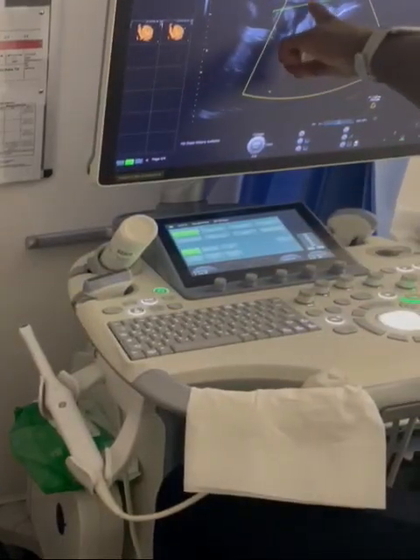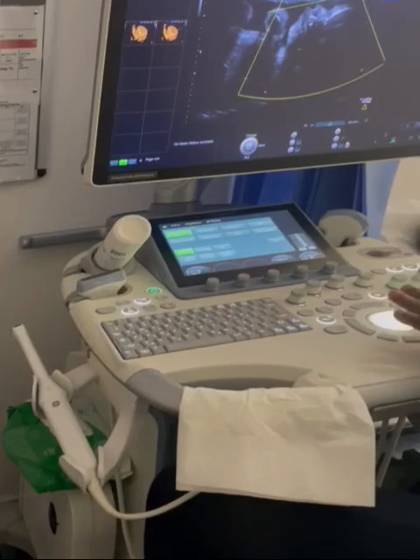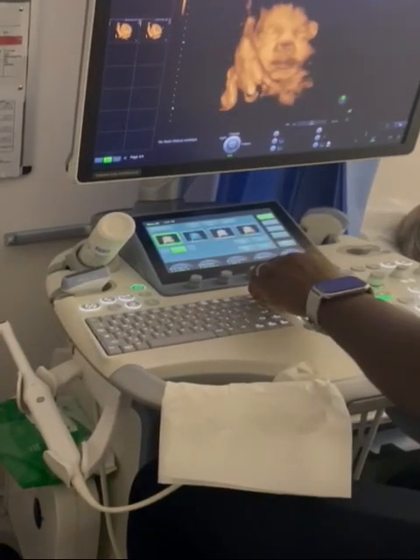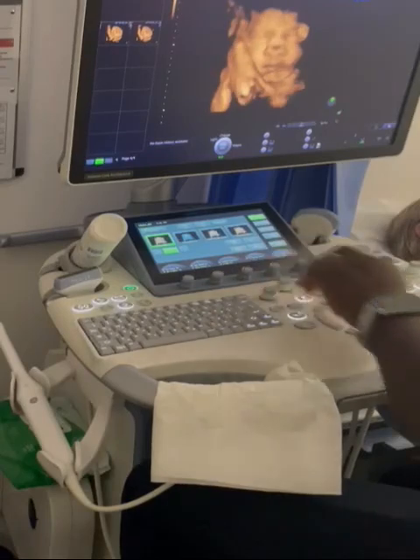Can you let me show them the green line? Okay. So you update the key. Update. You can see a beautiful face. She's a bit close to the wall.